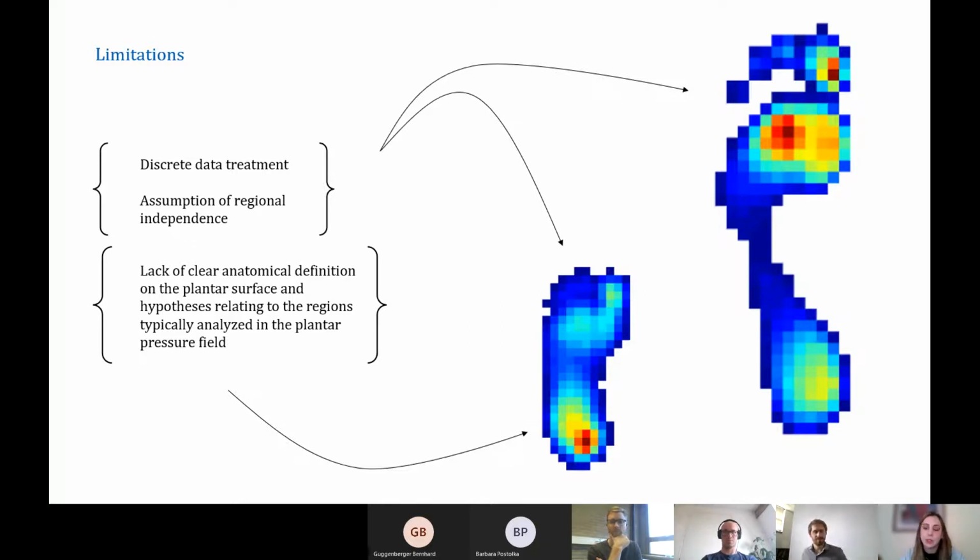Using software that has been implemented to analyze adult feet, based on adult foot algorithms, is a limitation in itself when we analyze infant feet, because the infant foot is developing, smaller, and pretty much very different.